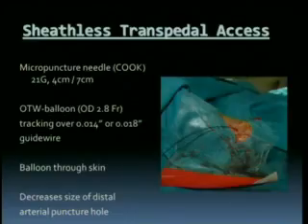So we planned to puncture the posterior artery at the ankle and then go upward with the support of a balloon in order to recanalize it. We used a sheathless transpedal access, in which we use a micropuncture needle from Cook. It is a 21 gauge, 4 centimeter needle; a 7 centimeter needle is required when we have to puncture the peroneal artery.